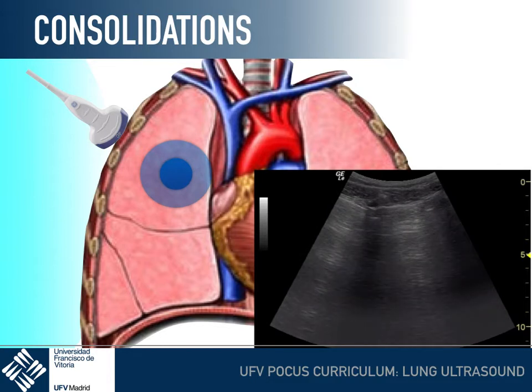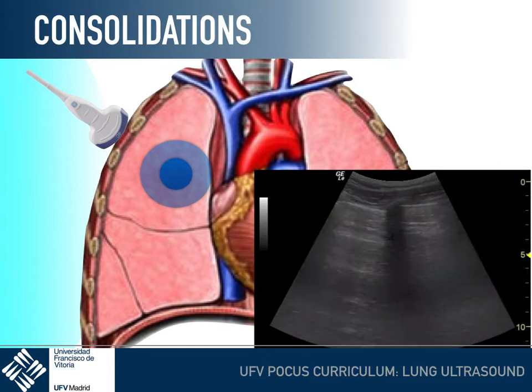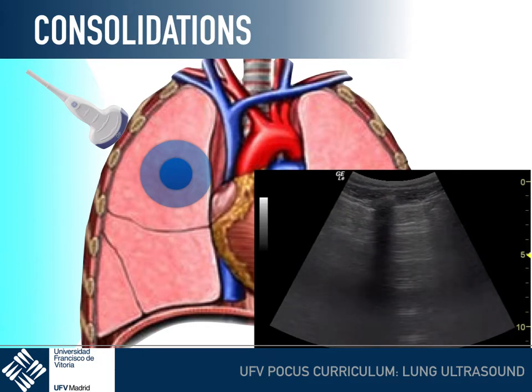Remember that A lines mean artifacts, so nothing that you're looking at is real. It's just a reflection.